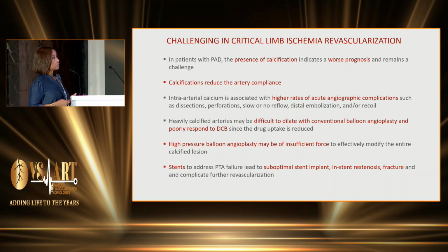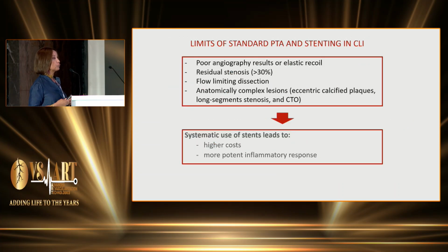Heavily calcified arteries may be difficult to dilate with conventional angioplasty and poorly respond to DCB. High pressure balloon on the other side can be of insufficient force, but also can damage the artery itself.